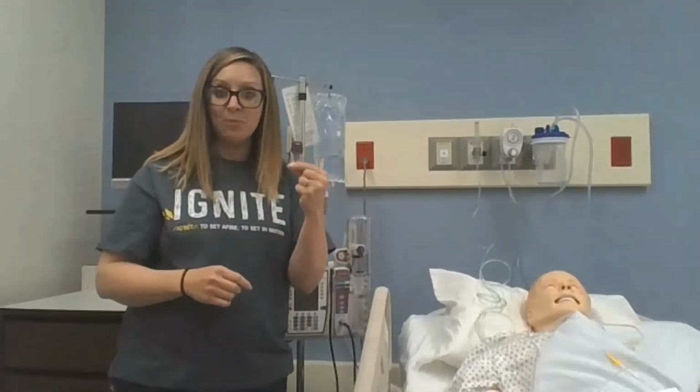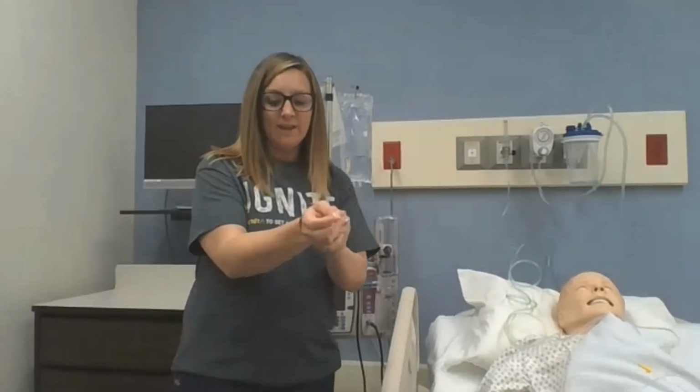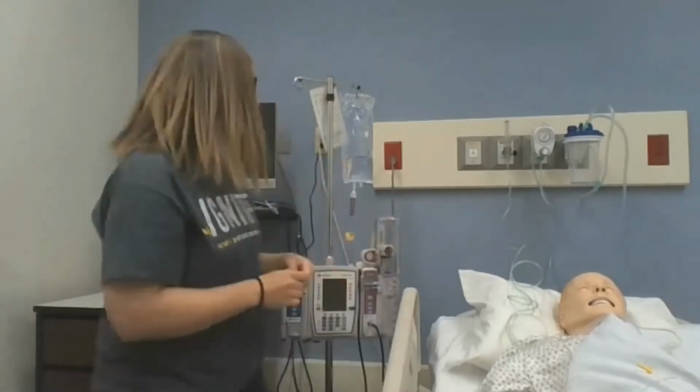You have to get this purple key out of the Omnicell. It's usually attached to something kind of like this hairband that I have, so you can have it for safekeeping. And then make sure after you're done with it that you return it to the Omnicell, because again, somebody else on the unit might also have a PCA pump and they need access to that key to make any modifications.